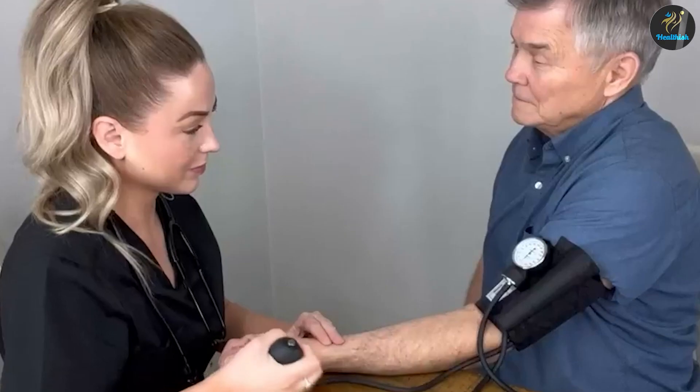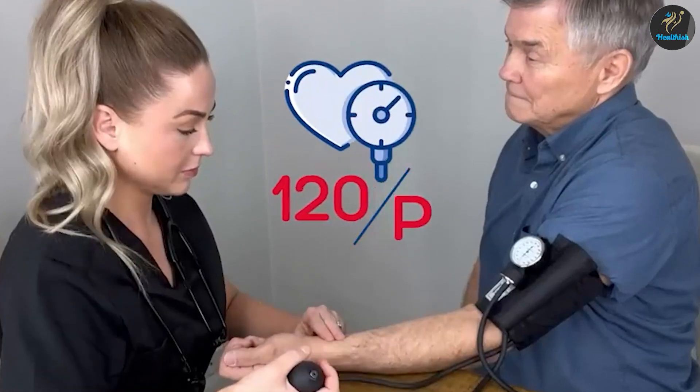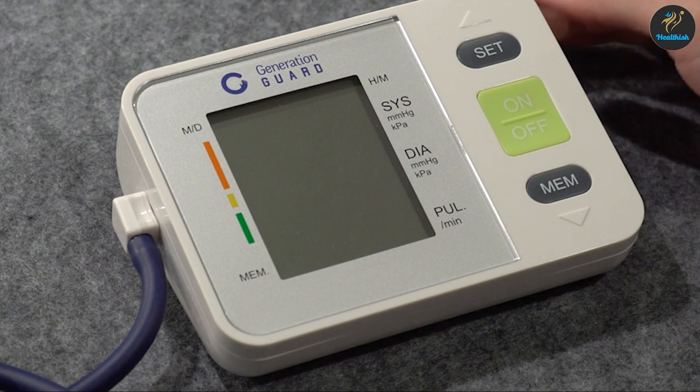There are two basic ways to use it: automatic or manual. The cuff, aneroid gauge, bulb, and stethoscope are the four main components that make up a blood pressure monitor.